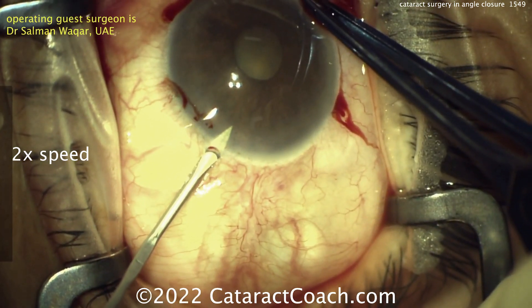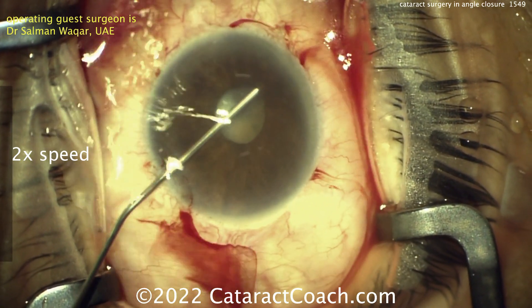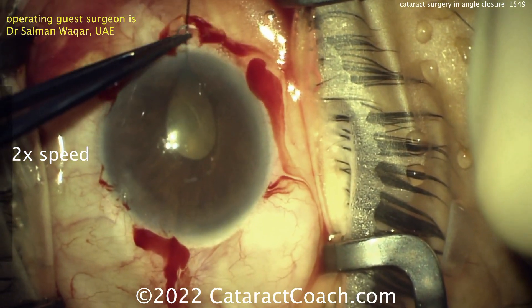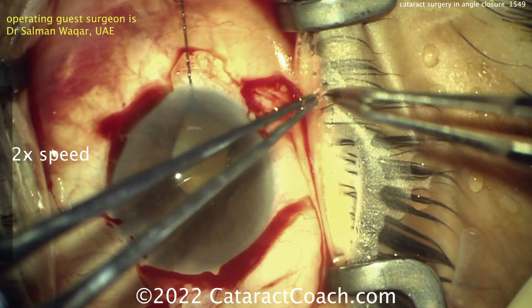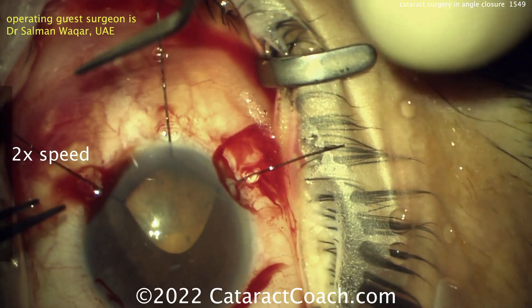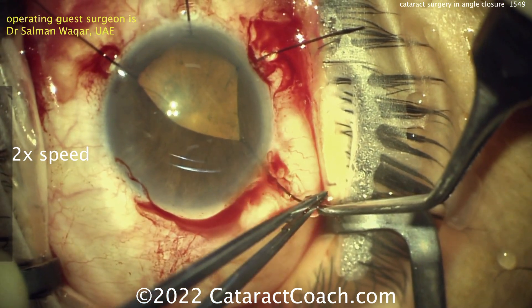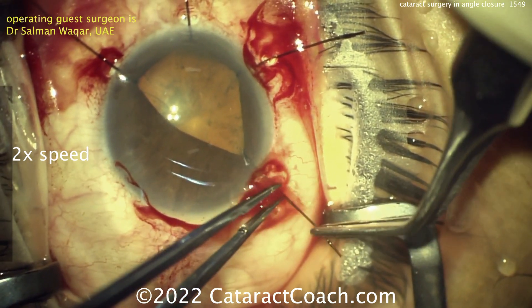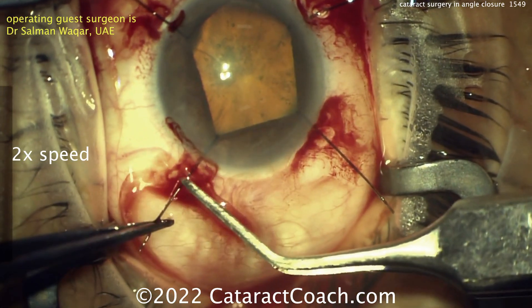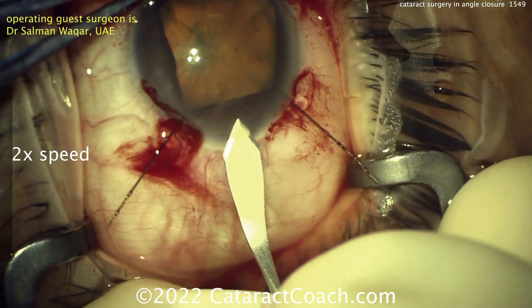You also need to make a paracentesis which is going to be a little bit wider incision and a different angle. Going inside the eye, you can try to break any synechiae that may exist here, put some viscoelastic, and now placing the iris hooks. Place them initially, put some tension on there, then go around and tighten them up a little bit further if you desire.